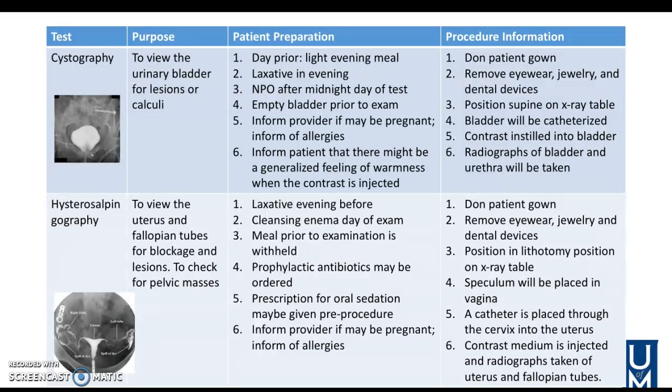So for these patients, we're going to instruct them the day before to have a light evening meal. They may have a laxative in the evening and nothing to eat or drink after midnight. They're going to empty their bladder prior to the exam. As always, we're going to inform if they may be pregnant or inform of any allergies, and inform the patient there may be a generalized feeling of warmness when that contrast is injected into their bladder.